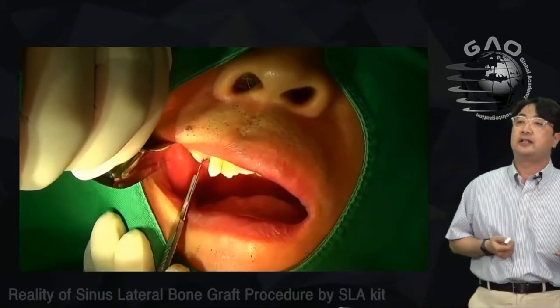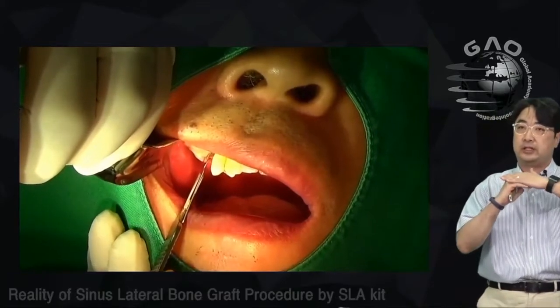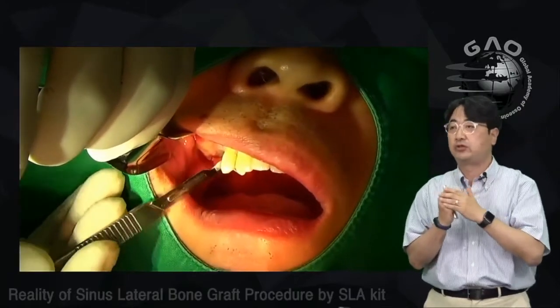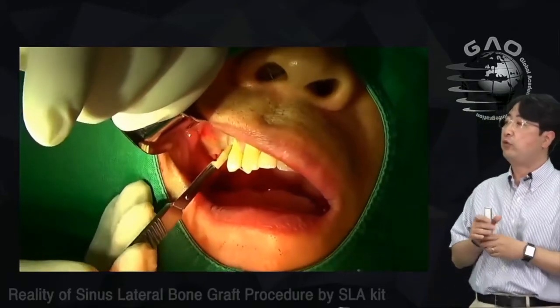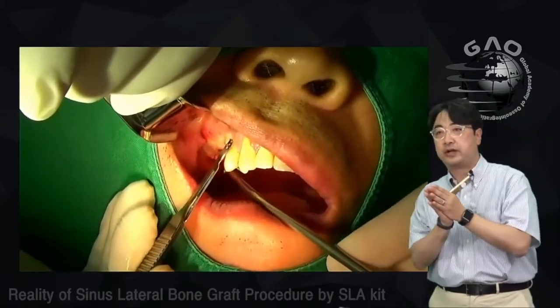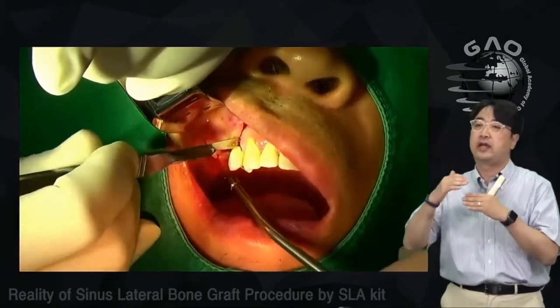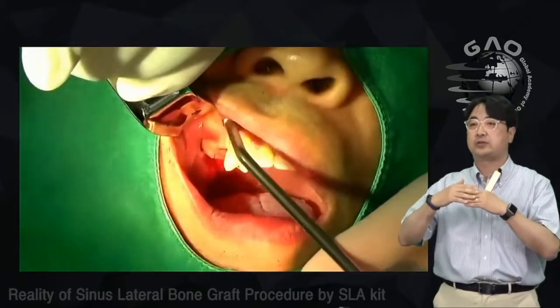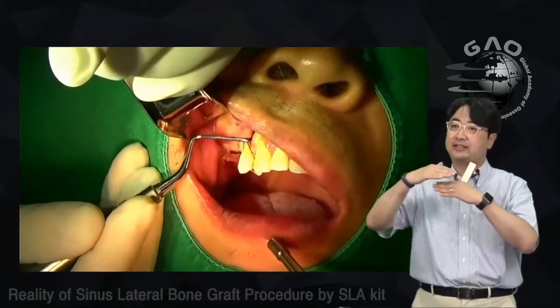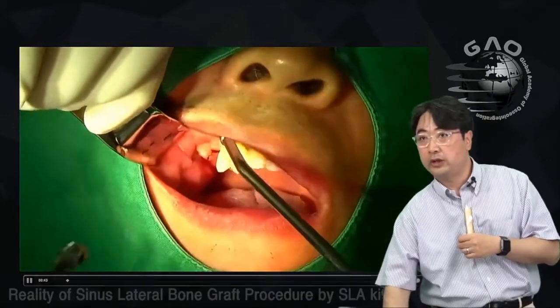My colleague didn't put anything between the maxillary sinus opening and the sinus membrane, so the periosteum and sinus membrane had adhered together. If you try to separate the sinus membrane directly from the periosteum, you'll have a big problem — tearing of the sinus membrane. You have to go above — dissect the muscle layer, not between periosteum and sinus membrane.